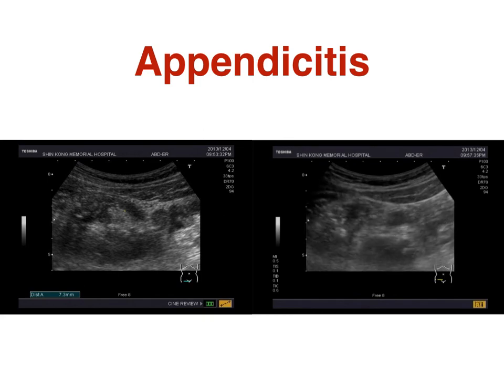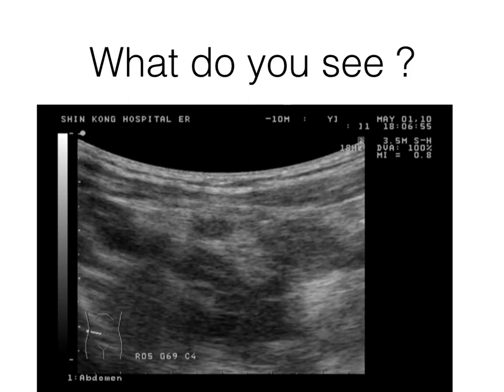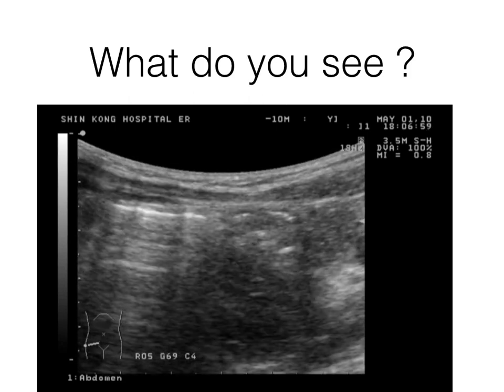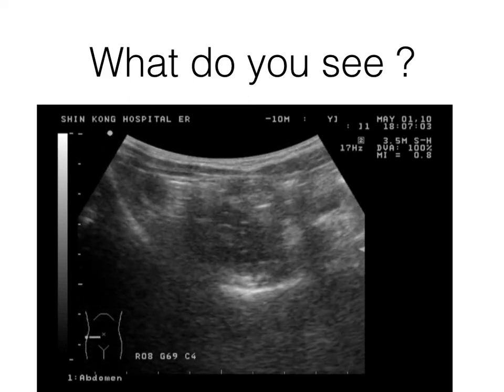So, upside down. Just seek for this, because time is limited. So what do you see? Iliac crest, small iliac vessel, quickly, so standard position for appendicitis. Do you see the appendicitis?